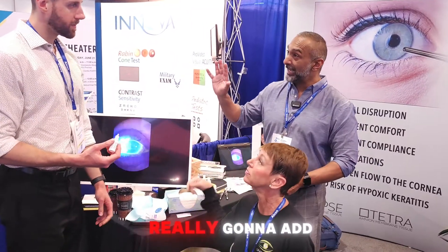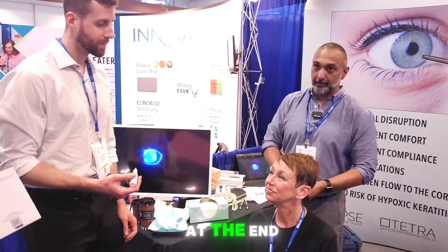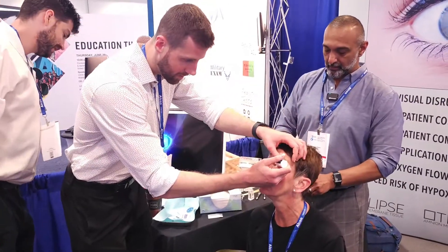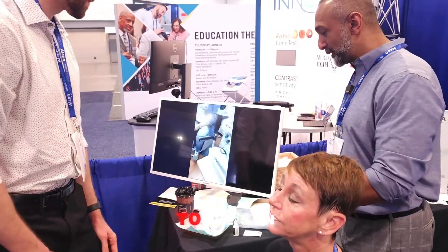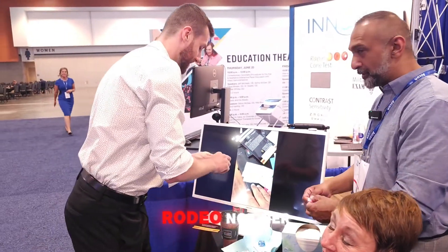There's no epithelial defect so it's not really going to adhere perfectly well — she'll be able to pinch it out at the end. We're treating one eye, but we'll put a drop in both eyes typically. For the demo we don't have to. She's an experienced patient — not her first rodeo.